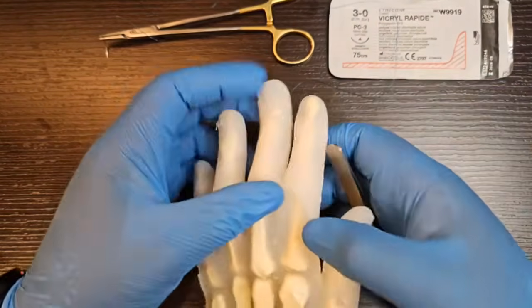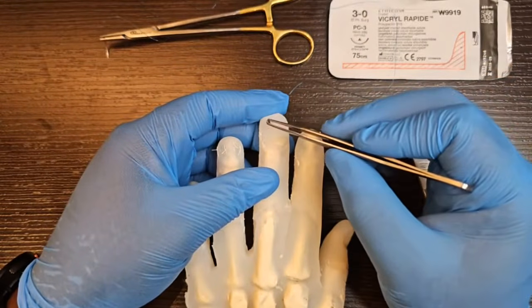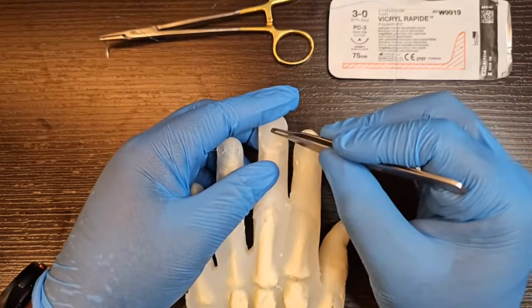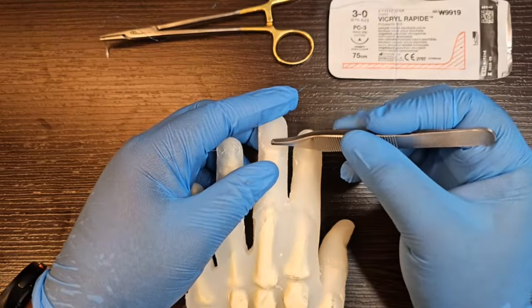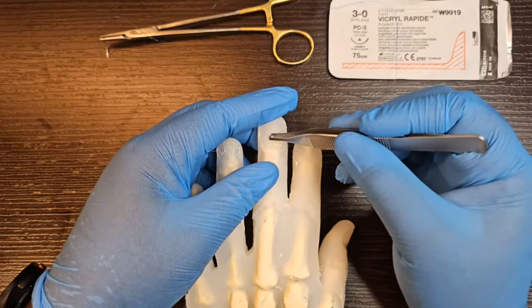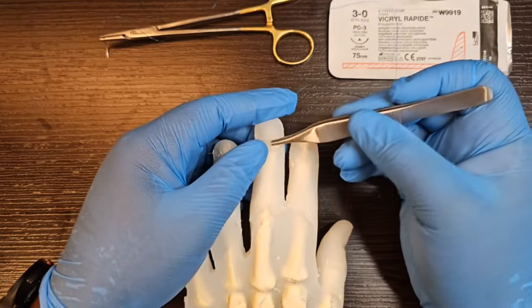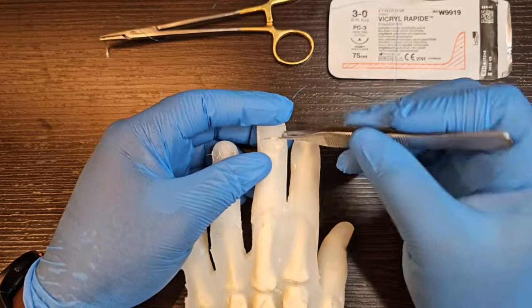You want to assess the matrix itself. So the part that you can see is the sterile matrix. If you look at your own fingernail, there'll be a little white crescent at the base between the nail bed and the eponychial fold. That's the lunula. Then underneath your nail fold is the germinal matrix. So this cut is across the sterile matrix.